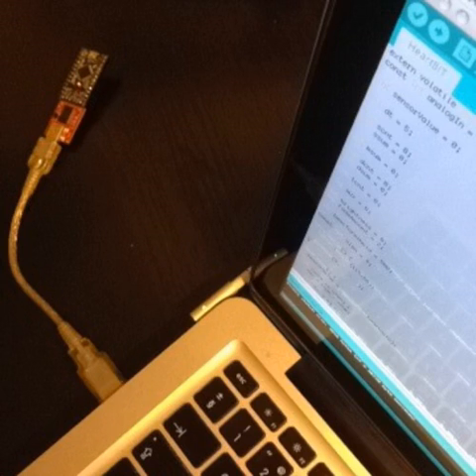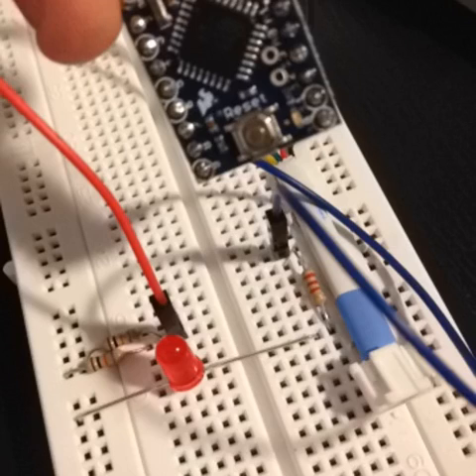Load a heartbeat sketch onto your Arduino board — in this case we're using a 3.3V Pro Mini. The sketch is prepared to use pin 9 to drive the LED, so hook up the resistor on the LED to pin 9 on the Arduino board.